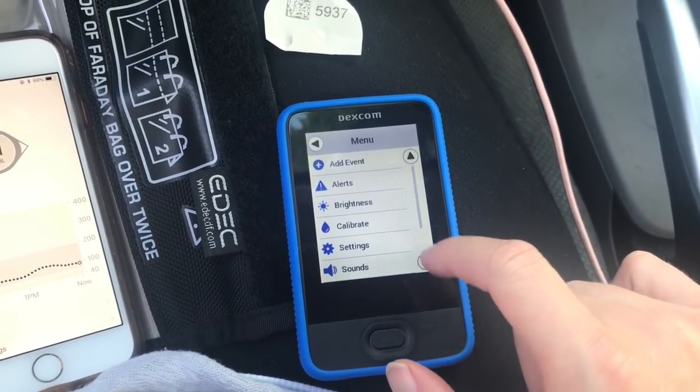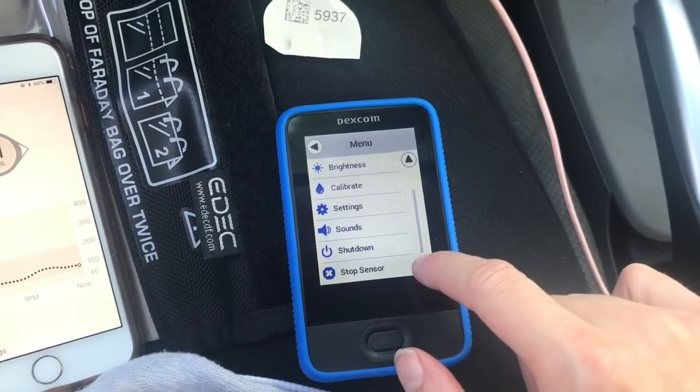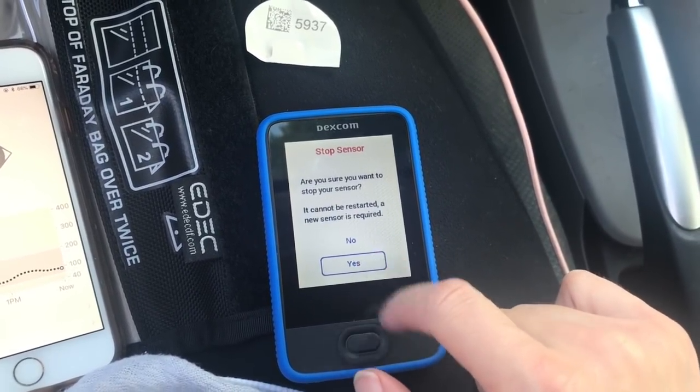We're going to unlock it, go to the bottom, say stop sensor, say yes.